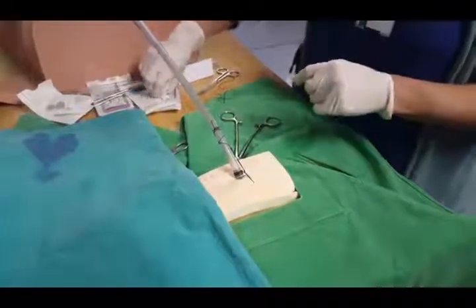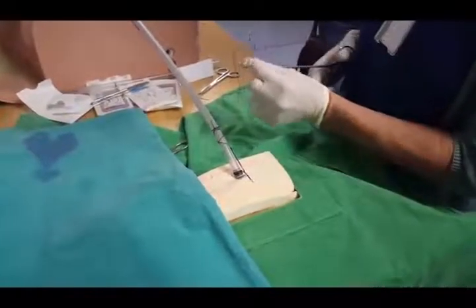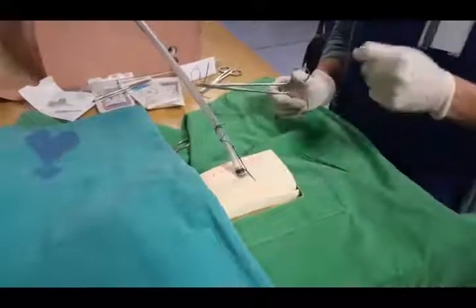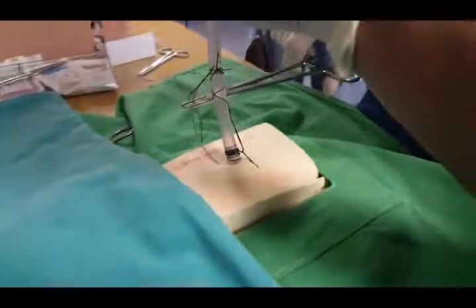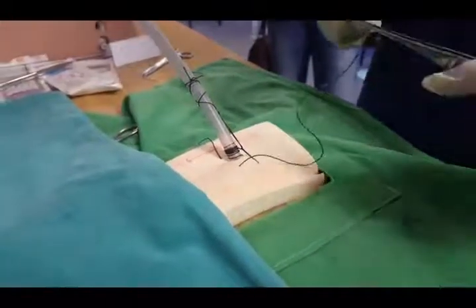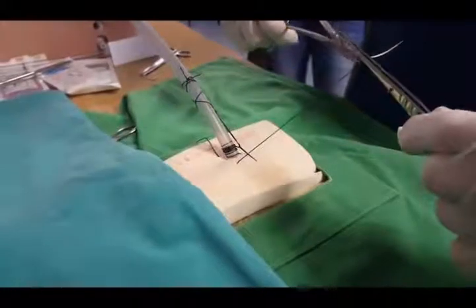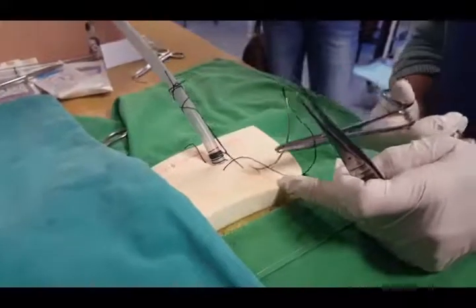Now what you're going to do is your u-shaped suture. This is to anchor the peripheral aspects of the incision when you take the tube out — just enough to catch the edges. You're going to leave a little tail. Obviously you can use extra suture material when you do this in a patient; just because this is a demo I'm not going to use too much suture material. Then you anchor in the peripheral aspects on the other side.